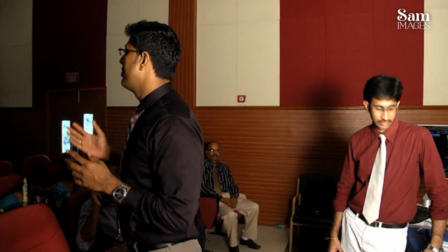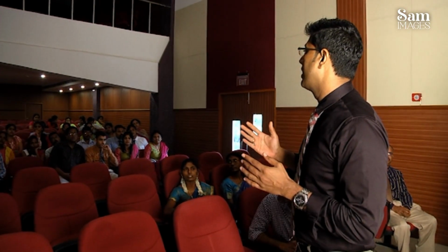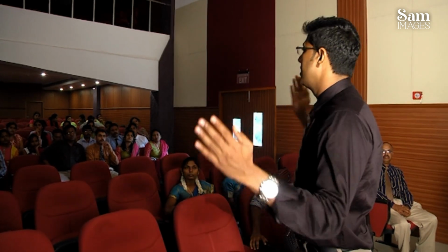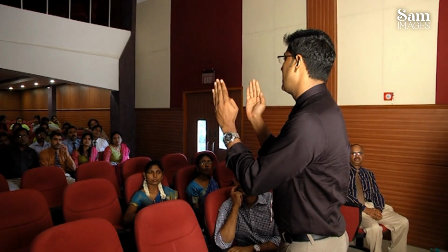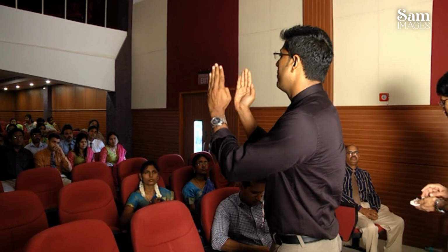That's what. In the second presentation, it was able to show the serous fluid under the graft. But that will not show color because it is not moving around. They have to move at a specific velocity. Basically, what happens in color Doppler is we'll be able to set scales. The computer cannot identify velocities over a wide range. So what happens is it is like a slider. The range of velocities that the ultrasound machine can detect will be limited.